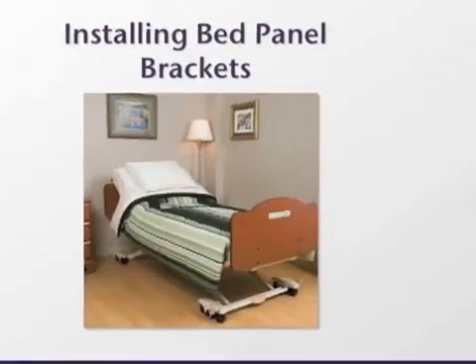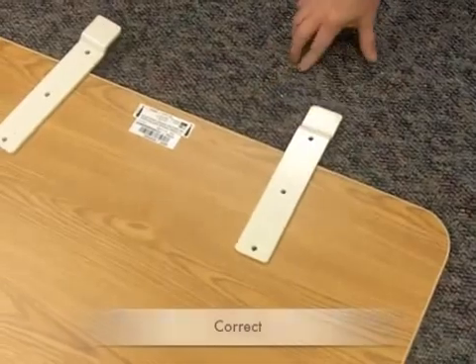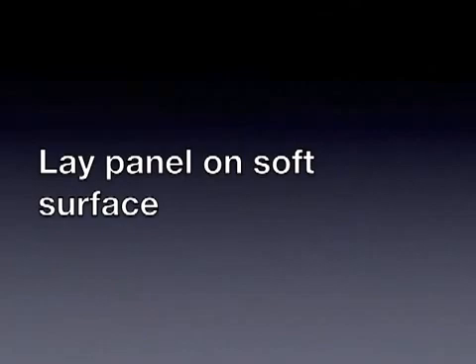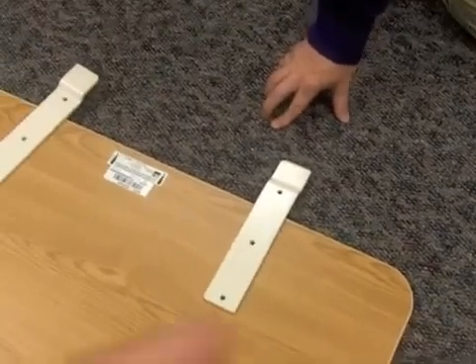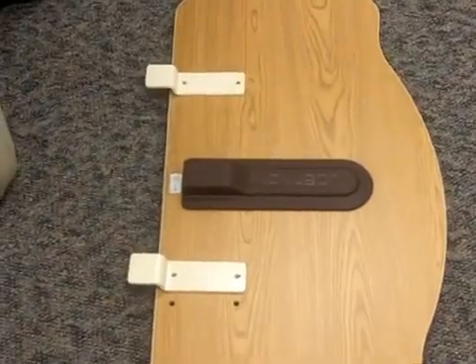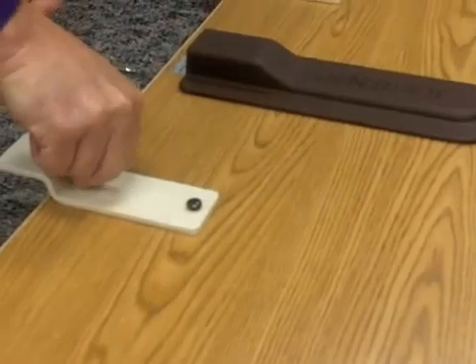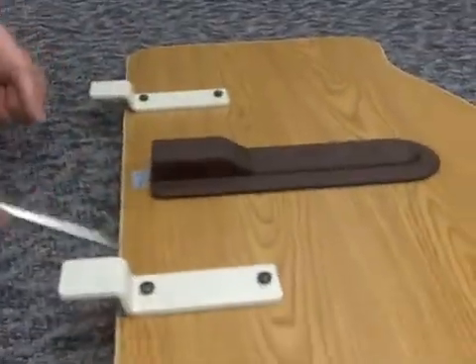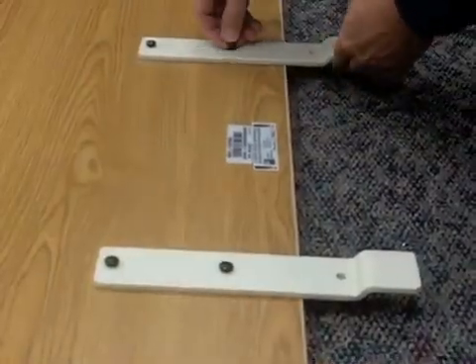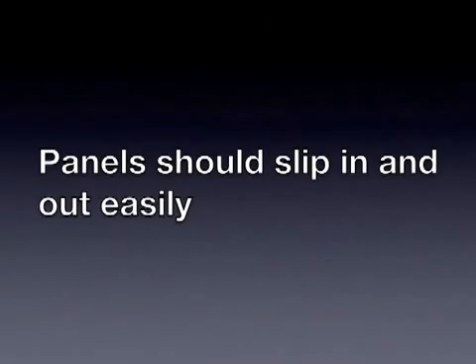The foot and head brackets can be placed incorrectly on the head and foot boards. Therefore, let's review the correct steps for placing both of these brackets. First, lay the panel on a soft surface. The head panel bracket is the longer of the two sizes. Then, align the top two holes with the bracket. The bracket offset should face up. Use the 4 screws to install the brackets. Do not tighten until after fitting the mounting brackets into the bed sockets. Repeat the same process with the foot bracket panels. Panels should slip in and out of their sockets easily.